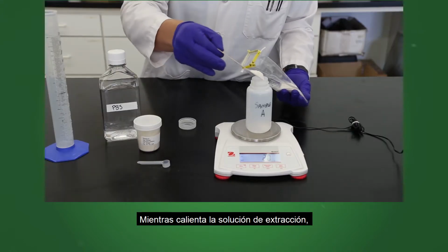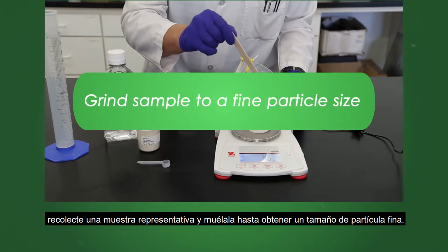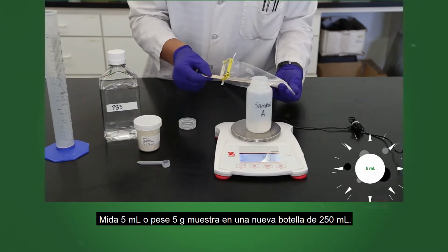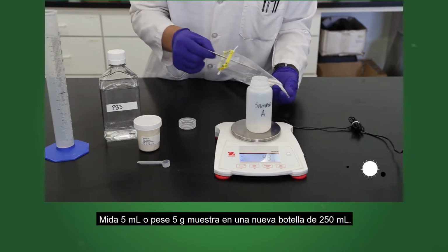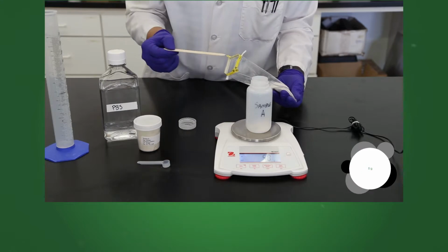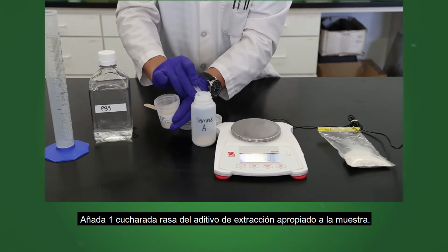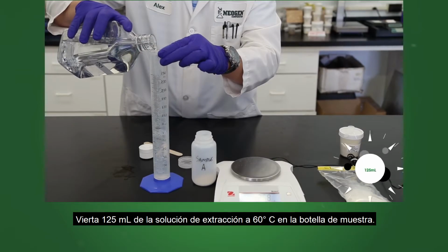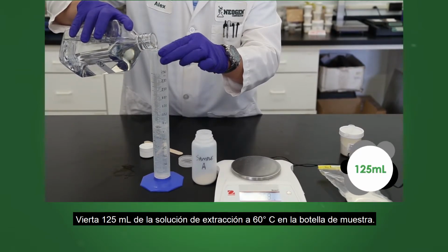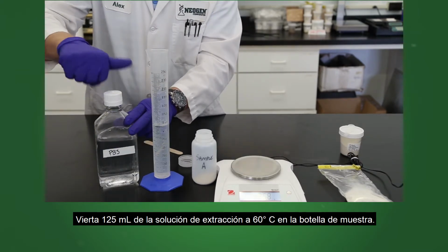While heating the extraction solution, gather a representative sample and grind to a fine particle size. Measure 5 milliliters or weigh 5 grams of sample in a new 250 milliliter bottle. Add 1 level scoop of the appropriate extraction additive to the sample. Pour 125 milliliters of the 60 degrees Celsius extraction solution into the sample bottle.